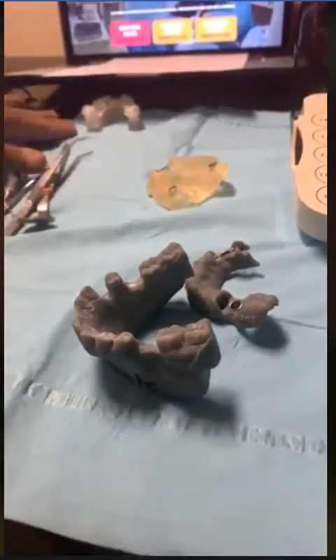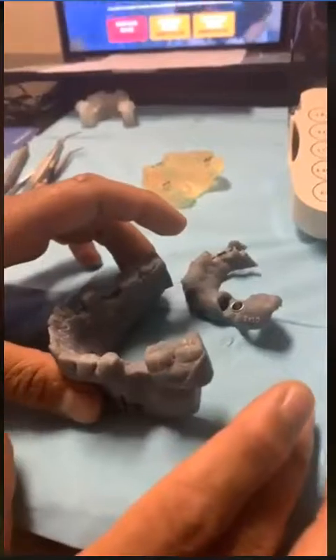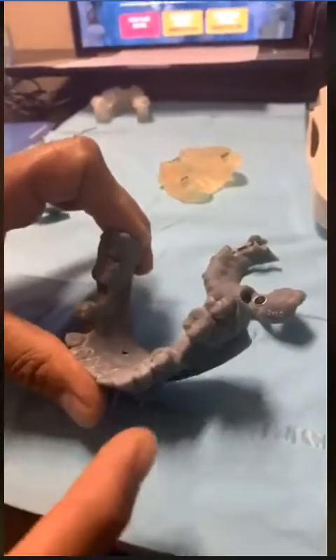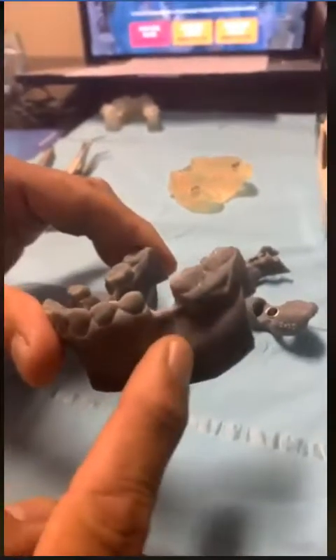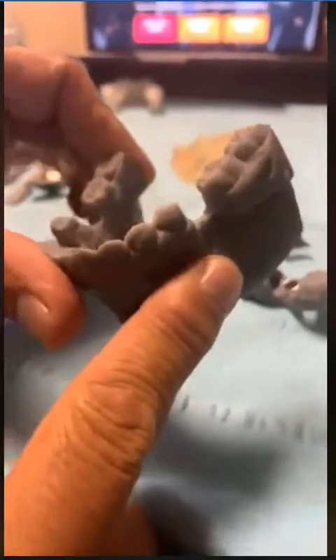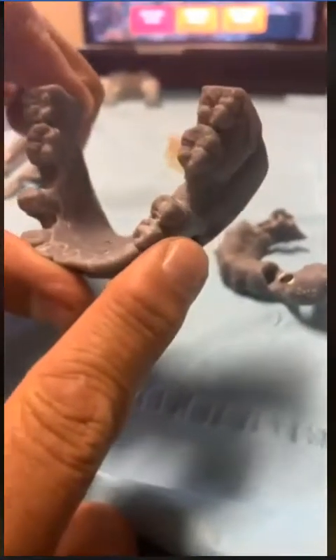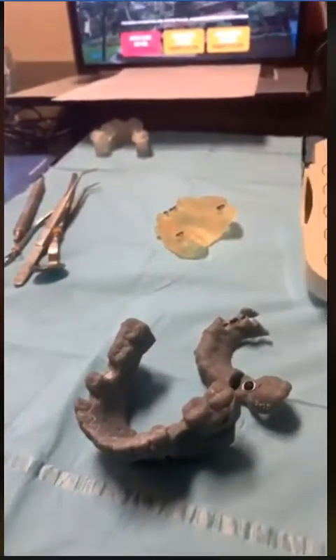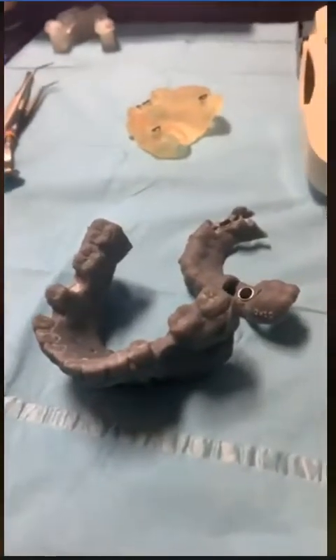Now I have these dummy implants that are 4.3 by 13, so we are kind of bound to do the surgery with a 4.3 by 13, but it gives me a good indication. Let's take a look and see. You see a little indentation here. Can you tell? There's a little indentation here. I'm going to get my lube for a second, if you will. Just give me a moment so we can do this.